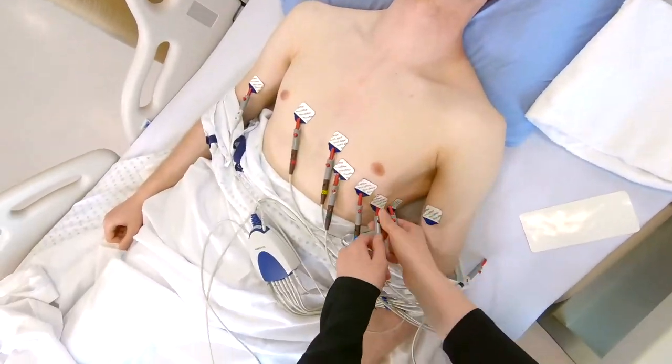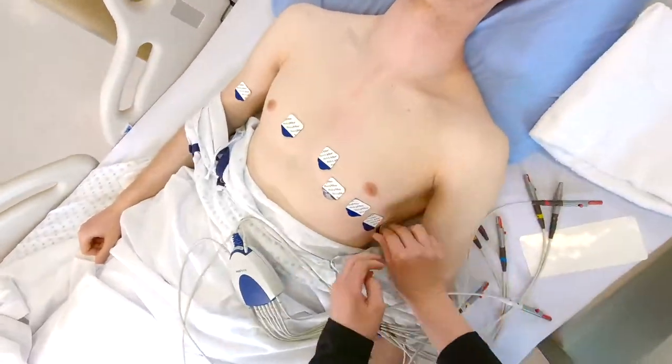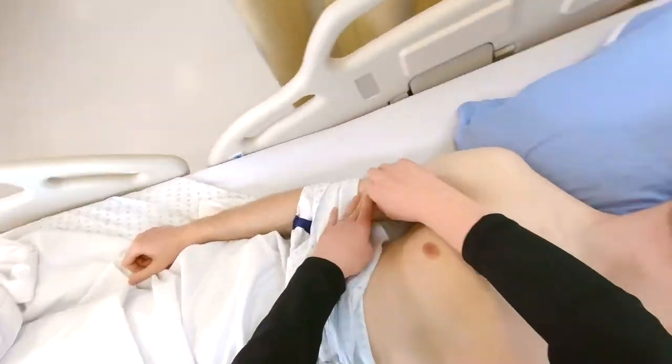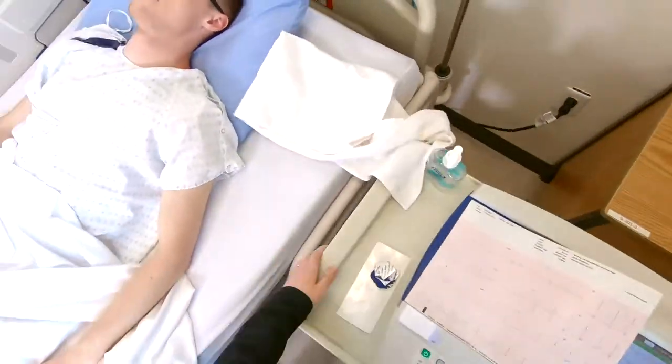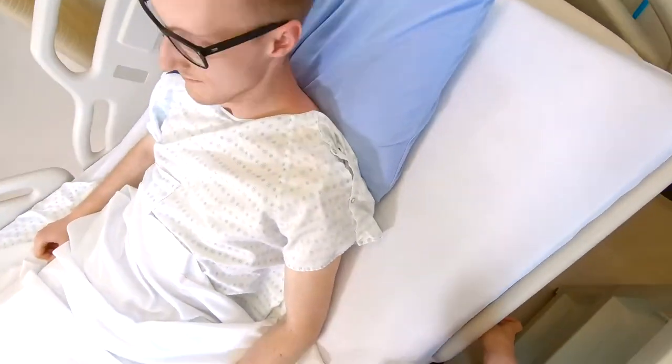Disconnect the leads, remove the electrodes, and position the patient to a comfortable position.